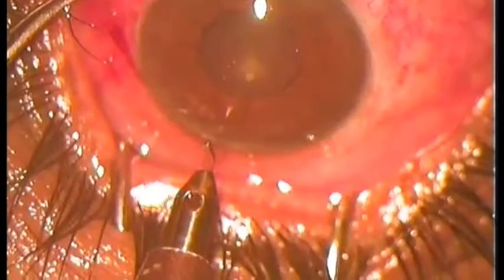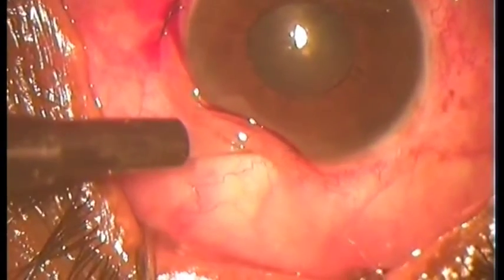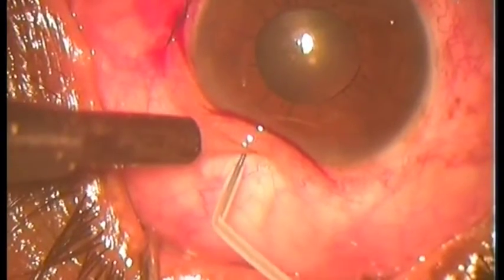Here is a patient. You make a gutter in the cornea with a knife. It doesn't open into the anterior chamber — the anterior chamber is still intact. Push the conjunctiva towards this gutter.